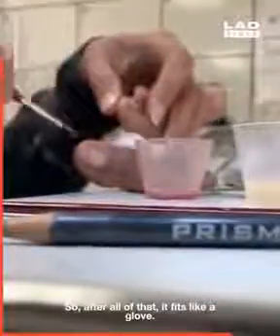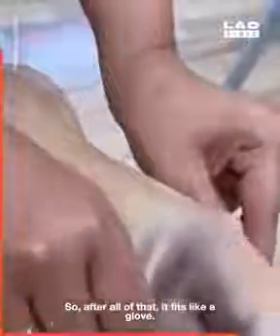We love making things look highly realistic, but our clients have to walk on their partial feet and fit them into shoes, so they need to stay on really well and feel good when walking around, which ends up being a lot of work. So, after all of that, it fits like a glove. The piece is applied with hand sanitizer.